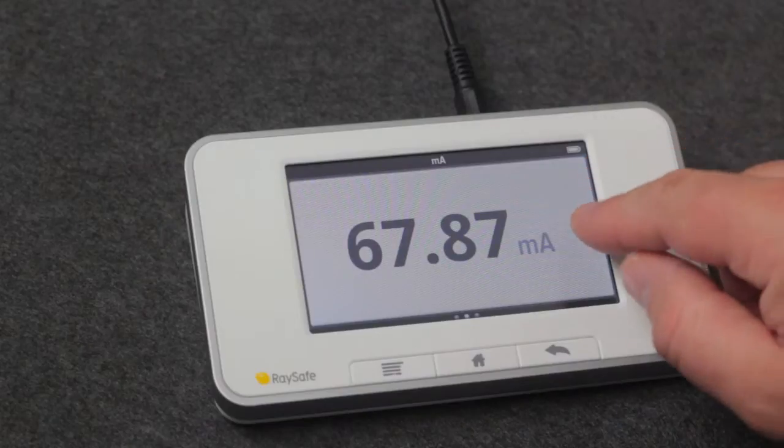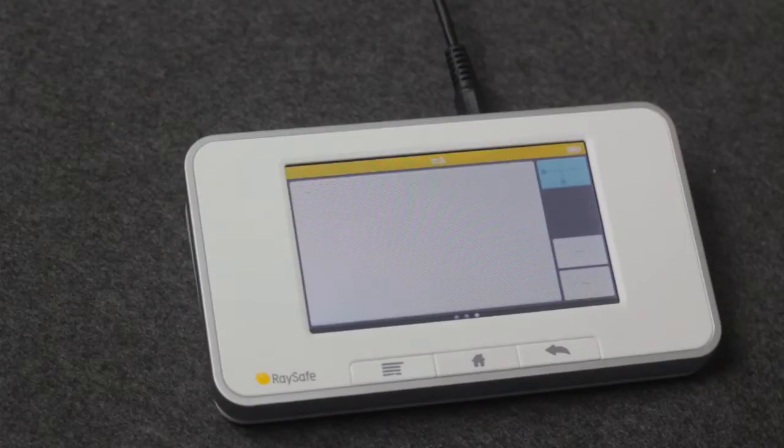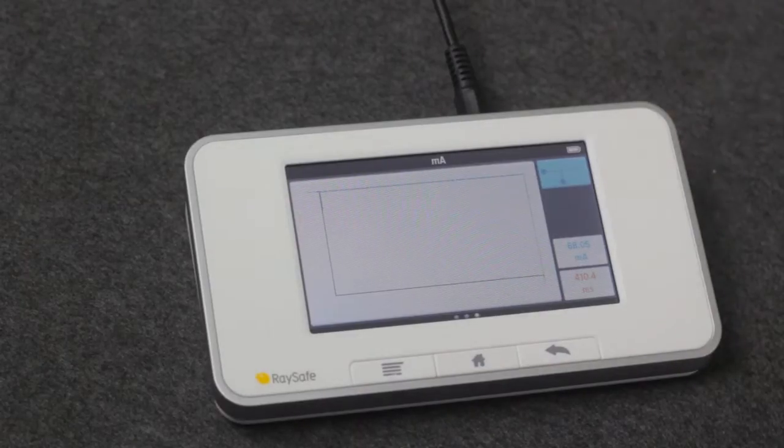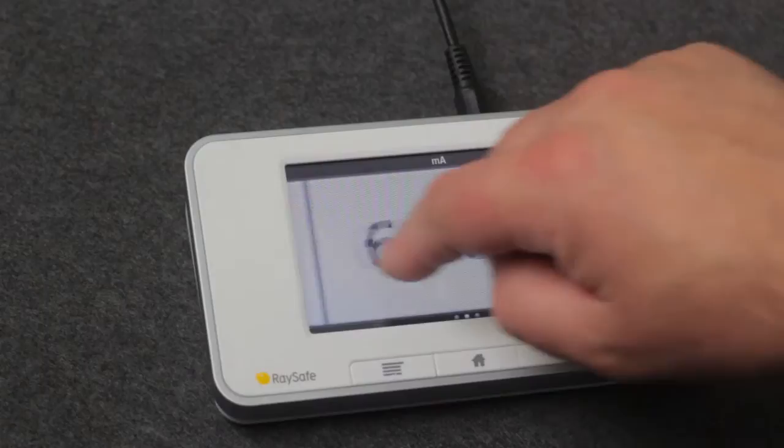To see the waveform, swipe left, and for the next exposure this behaves exactly the same. To see the specification of this parameter, swipe right two times.